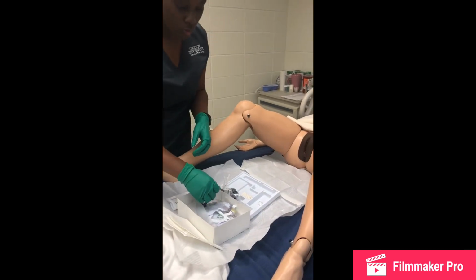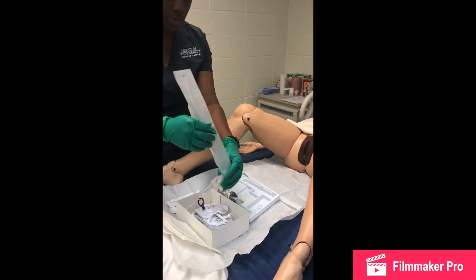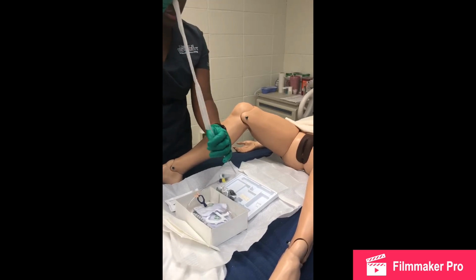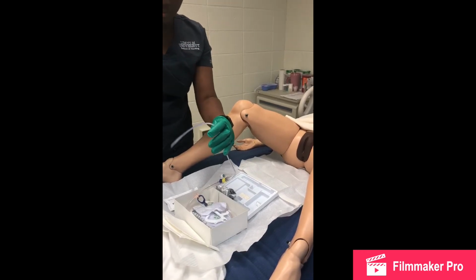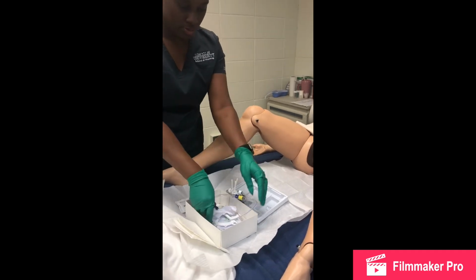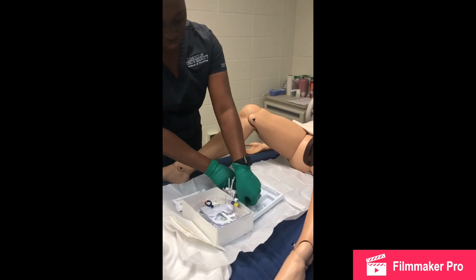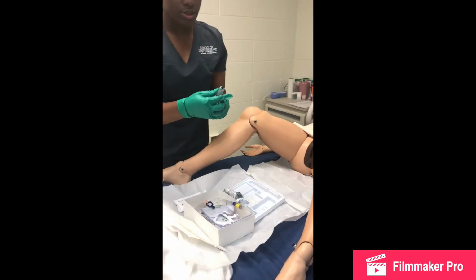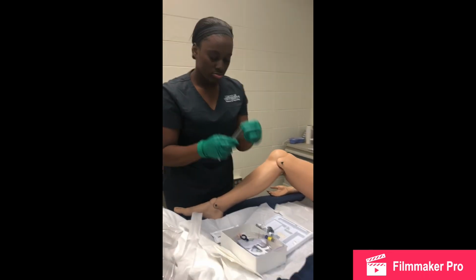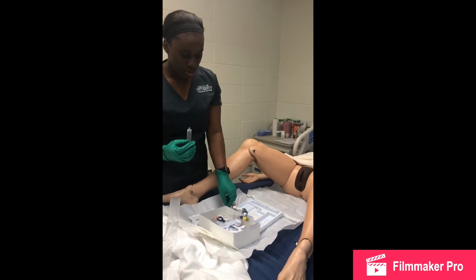Right, then now we're going to test the balloon to make sure it works before inserting in the patient. So I'm going to carefully take this part off. Press it right here. And get my syringe. Now there is 10 milliliters or cc's of fluid in my syringe, so I'm going to carefully note that that's the amount we're putting in.